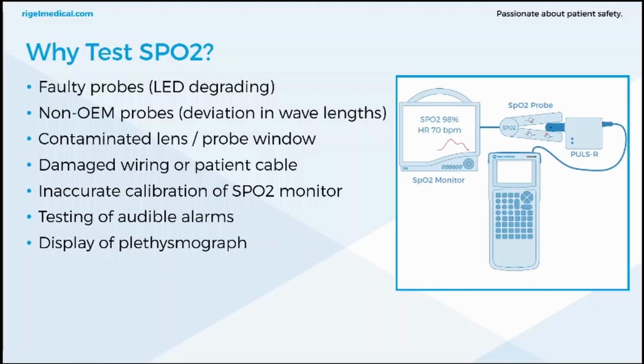So overall, these tests are to verify the performance of the monitor measurement circuits, the SpO2 probe characteristics to trigger any alarms. They also ensure that the monitor can accurately measure different pulse volumes. Probes are also consumables, so they can suffer wear and tear, they're easily replaceable, so it's important to test the functionality of each probe.